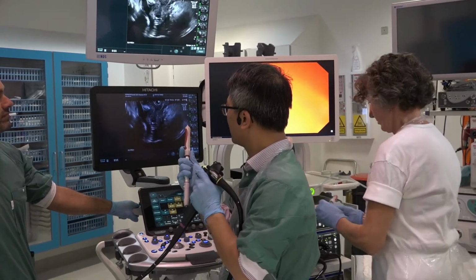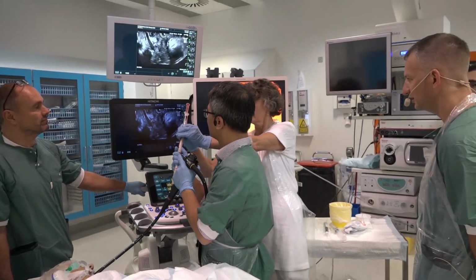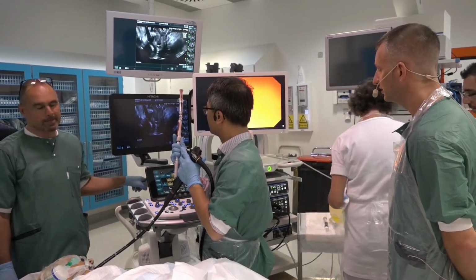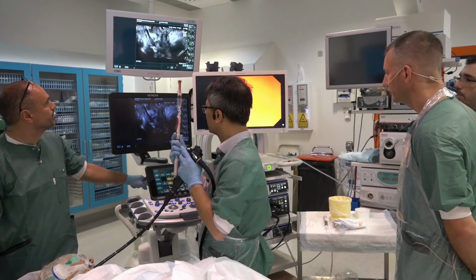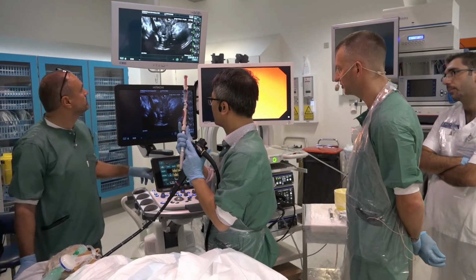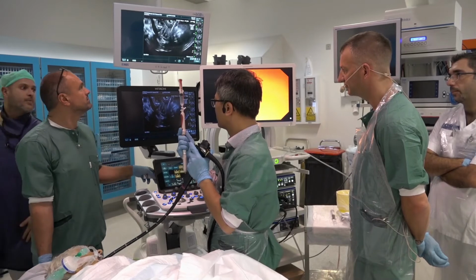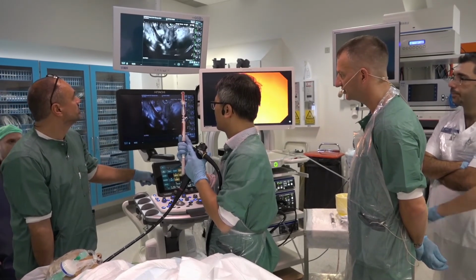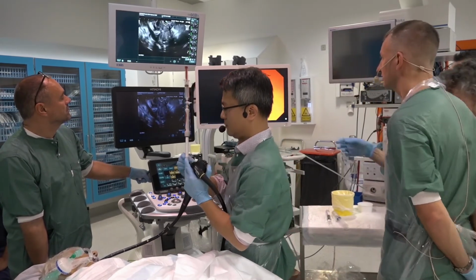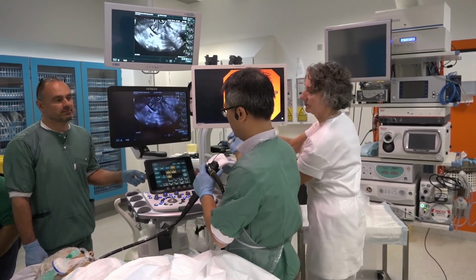Well, we did not see any obvious, I think, cancer on the endoscopy view. Like that there would be a cancer of the duodenal mucosa infiltrating the pancreas. I'm not saying that it's not possible. Definitely there is a very tied close relationship of the two. Sorry. And so we remove everything.